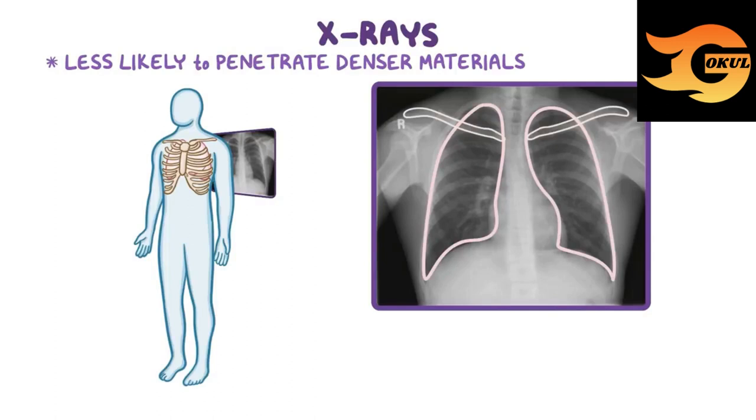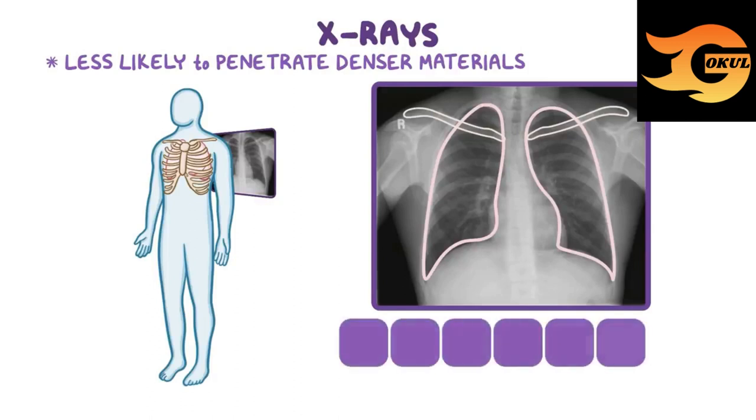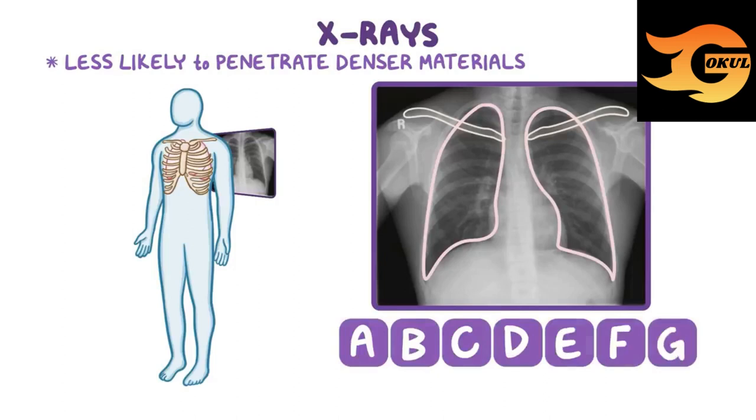Let's go through this chest x-ray using an easy-to-remember checklist, associated with the first seven letters of the alphabet: A, B, C, D, E, F, G.